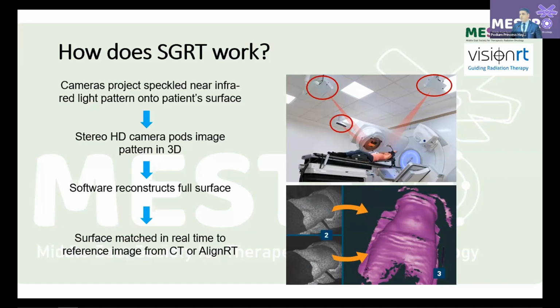That reconstructed 3D surface is then compared to your original reference. Whichever way you scanned your patient, whichever way you generated a 3D contour, you are doing a real-time fusion between your live patient position and the reference position for the whole treatment process.